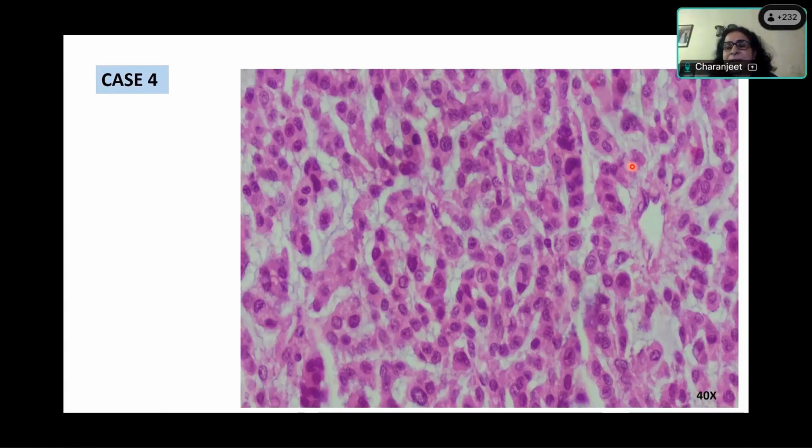If I say that it is not a dural-based mass, it is in the brain parenchyma itself, can you think of any other differential with this chordoid morphology? So this is a chordoid morphology. So always remember, chordoid morphology could be a chordoid meningioma. It could be a chordoma. So you have to read your history carefully. And third, anything else? If it is in the brain, yeah.